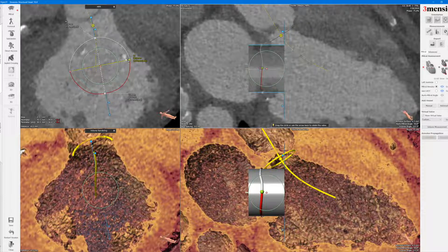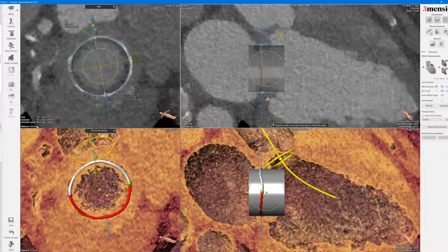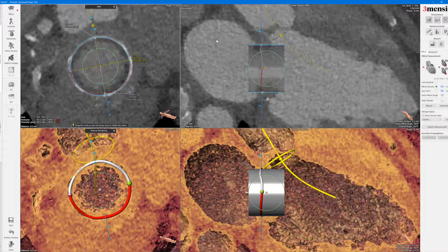Ideally the two poles would align in the LVOT, but sometimes it doesn't happen, and sometimes it would be totally misaligned in terms of the commissural post position. So once you have that, you can go back and scroll back up to the zero millimeter plane — the plane that you derived — and then you can right-click.